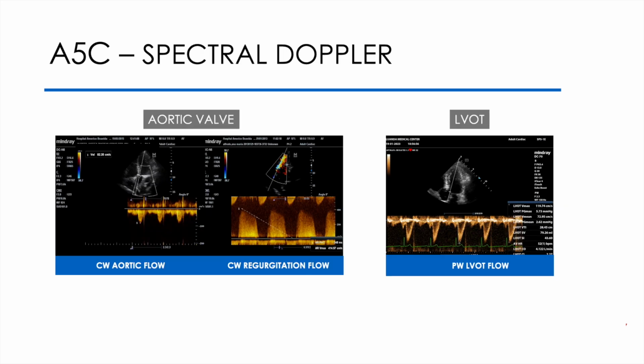Then I keep the cursor aligned with the aortic valve and call the CW Doppler because the aortic velocities are higher and sometimes the PW does aliasing, okay? When pressing for the second time on the CW command, it calls the spectral Doppler and gives us a negative systolic flow because it's a flow that moves away from the probe, with this triangular aspect. As I have already mentioned, whenever we activate the spectral graph, it is important to orient the baseline and velocity scale so that we can visualize the peak of the curve to be studied.